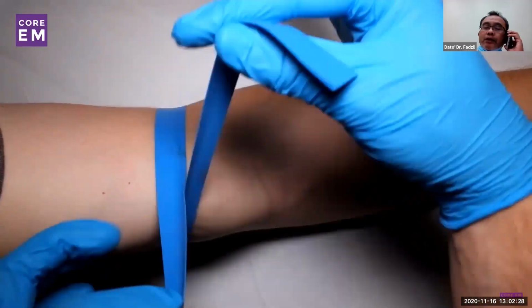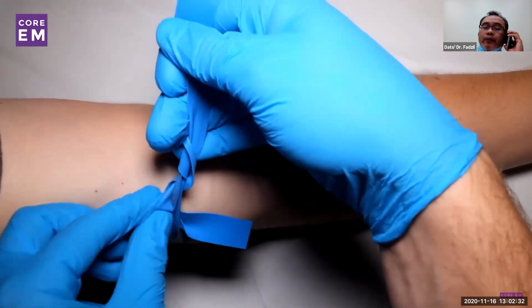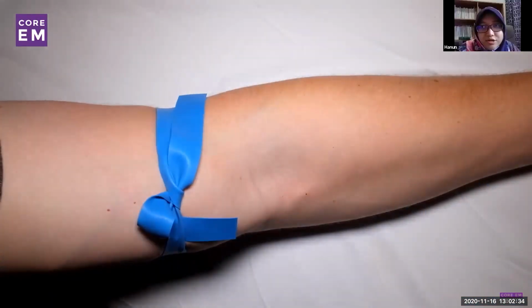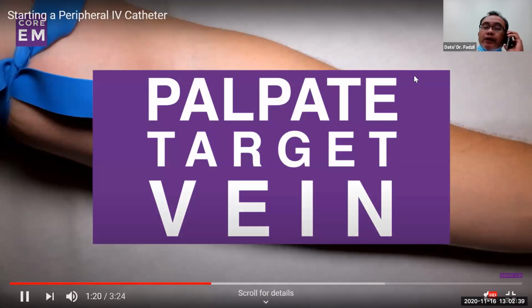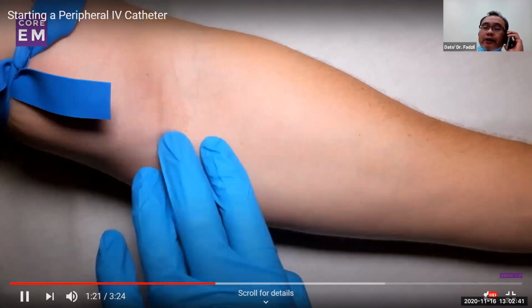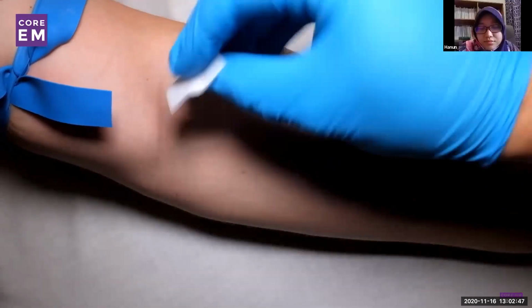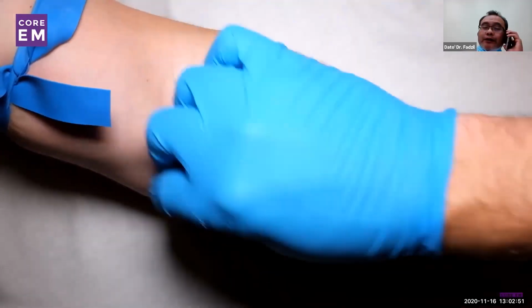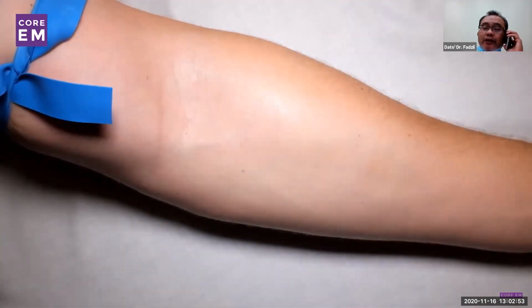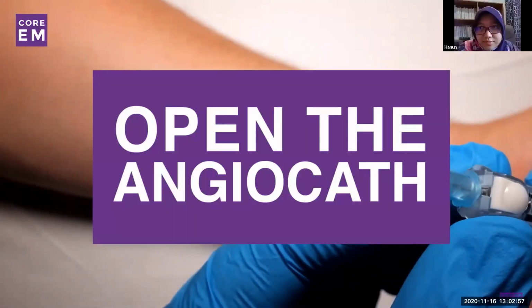As long as we are concerned, like case people tu, cuma bezanya lah dia have to understand. Itu tourniquet lah. Tourniquet is to stop the... There will be some charging kalau dia masuk ke hospital kita, because this charging is for you all. That's it for apa? Dia puncture the vein lah. Lain semua tak ada apa-apa. The catheter. The only problem is the alcohol swab, to make sure they are all clean.